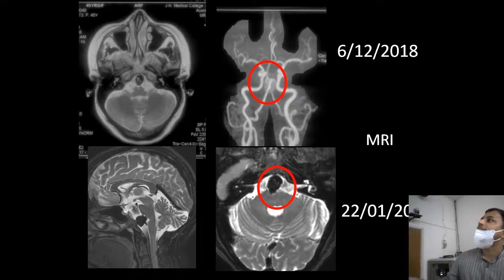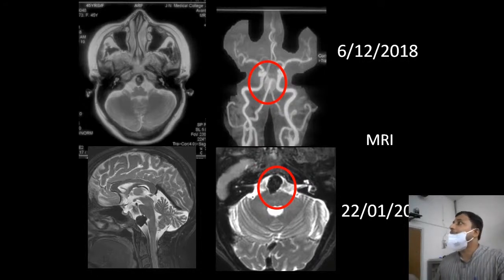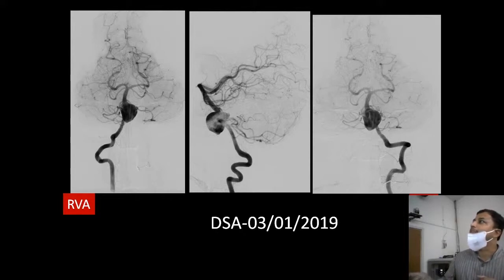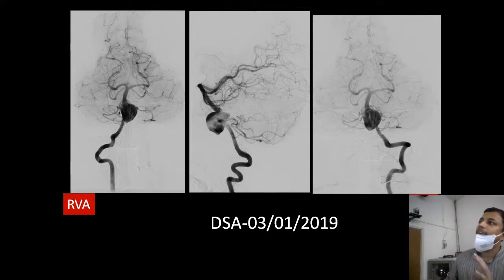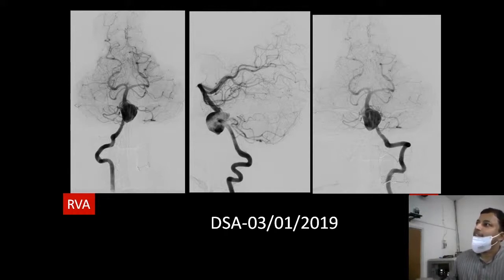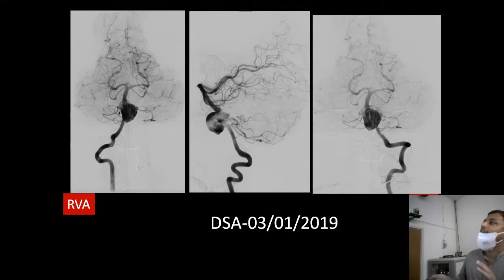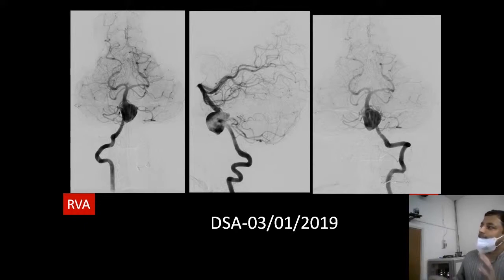These are the angiographic images showing the two vertebral arteries — right and left — and the aneurysm at their junction. A DSA cerebral angiogram was performed on January 3rd. On the right vertebral angiogram in AP and lateral views, we can see the V3 and V4 segments of the vertebral artery, the basilar artery, and the two posterior cerebral arteries. The aneurysm is located in the proximal basilar artery. On the lateral view, the posterior aspect appears triangular — the likely weak point and most prone to rupture. On the left vertebral run, the aneurysm, basilar artery, and posterior circulation are all filling. We also noted the somewhat abnormal course of the right vertebral artery.